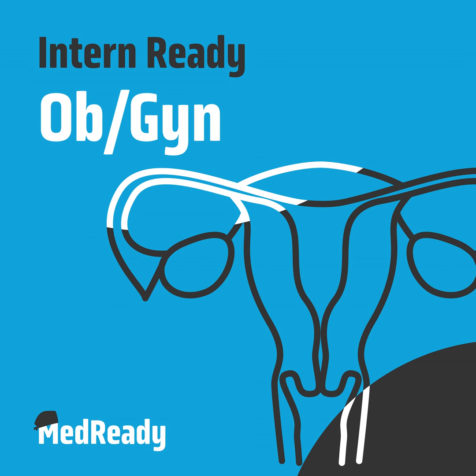And then we'll place the pressure for the hysteroscope fluid lower than that because we want to limit the amount of fluid that, based on pressure differentials, would move outside of that system. Right. Moving from a high pressure system to a low pressure system. Exactly. So your pressure inside the uterus, you don't want that higher than the pressure in the rest of your body. Right. If you're starting to approach the maximum deficit and worried about the effects on the patient, sometimes you can just stop the procedure.